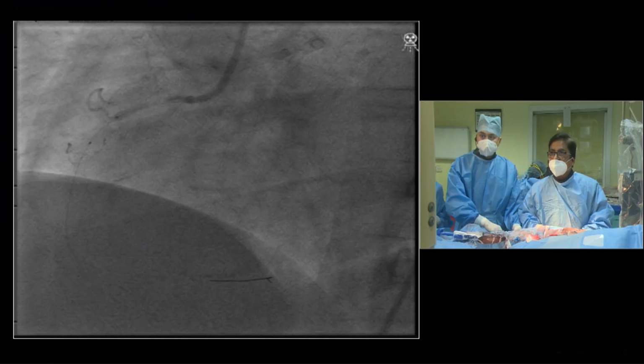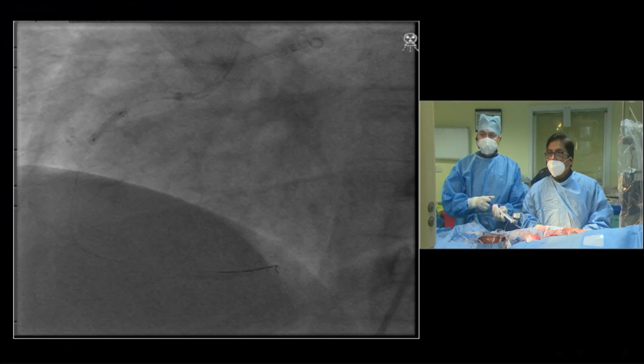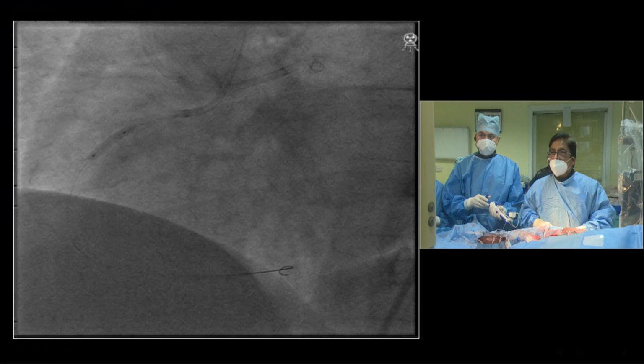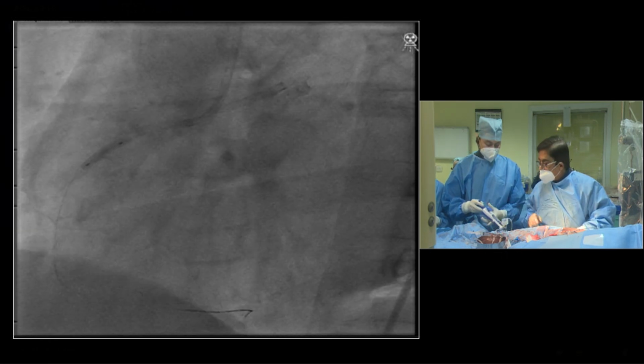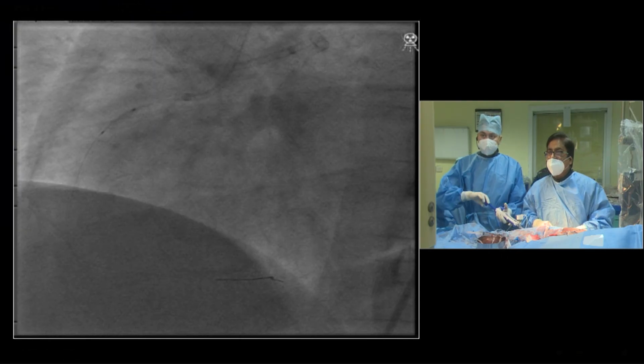Okay, come on, inflate. Oh, hold on. Okay. Keep it. This is 15 mm? This is 14, sir. No. The balloon? 12 millimeter. Down, 12 millimeter. It is 12? I think it's 12.